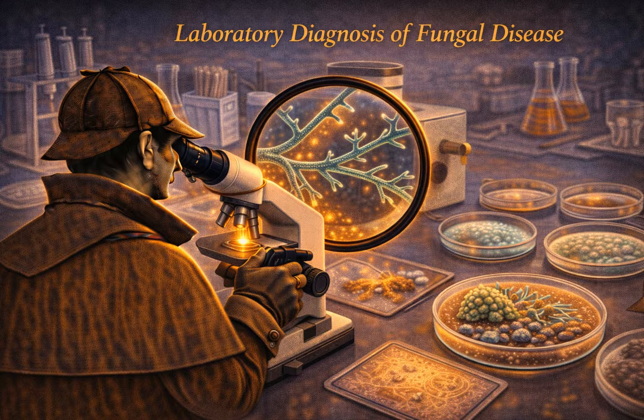And there's the major issue of the specific patient population we're dealing with. Exactly. Think about who gets severe fungal infections. Immunocompromised people, leukemia patients, transplant recipients, advanced HIV patients, people whose immune systems are broken. They physically cannot make antibodies efficiently. So you run a serology test and you get a false negative because their immune system is just too weak to mount a detectable response, even while the fungus is actively killing them. So serology is mostly out for acute diagnosis.